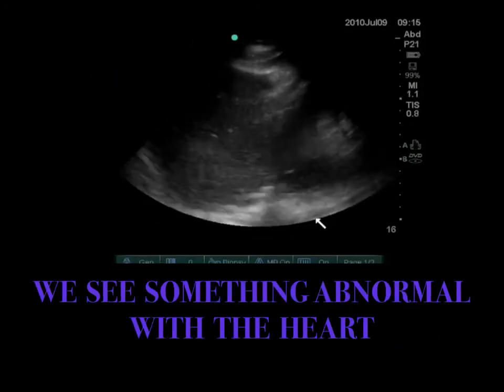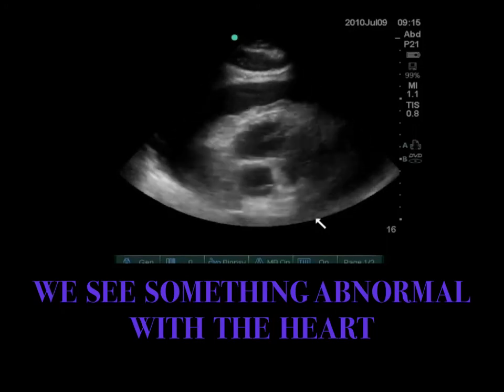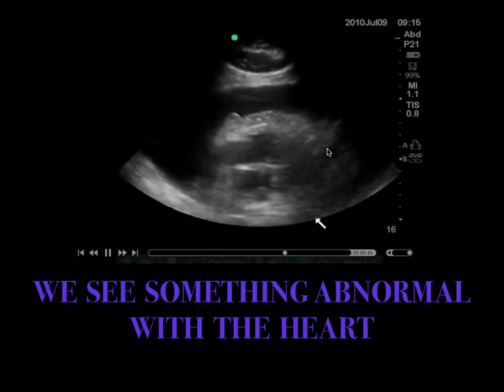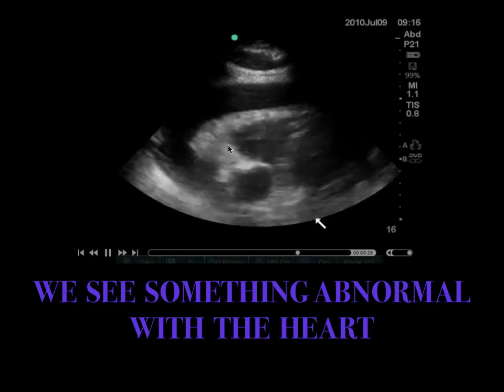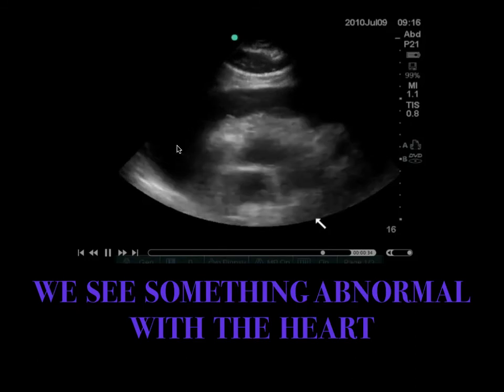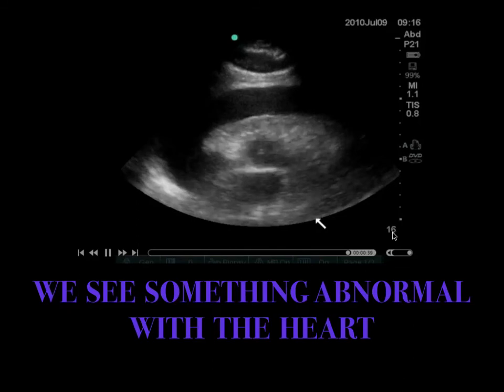So what was abnormal? A very active heart, desperately trying to pump inside a very large pericardial space, a very large pericardial effusion. And again, there's no exact measurement here, but take a look at the size from here to here, and you can estimate how big this is by looking at the scale. Over here, 16 centimeters, but then here, each one is indicating 1 centimeter difference. So from here to here is probably 3.5 centimeters. Very large effusion.